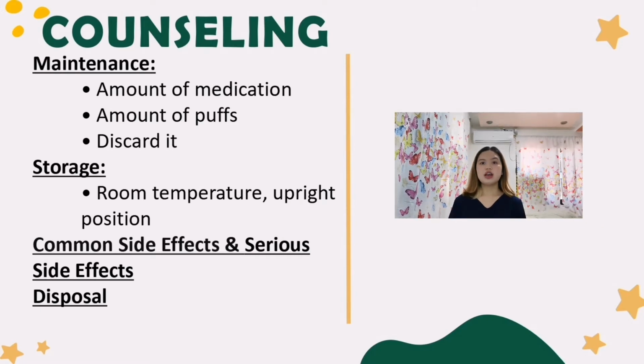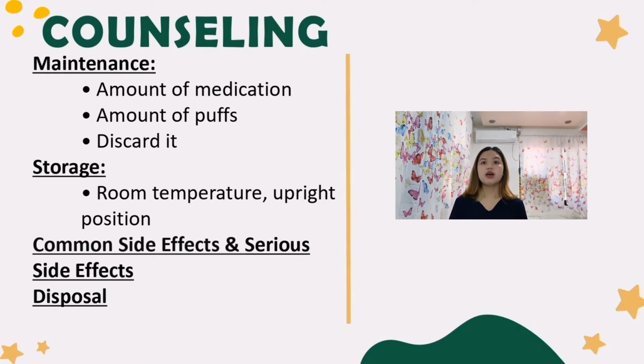The common side effects of using an MDI inhaler are fast or irregular heart rate, chest pain, shakiness, nervousness, and others that are written in the output. It also has serious side effects such as tightening and swelling of the muscles around your airways, with symptoms of trouble breathing and wheezing. Disposing of it properly is a must. The best way to dispose of it is by giving it to the local pharmacy since it is considered hazardous waste.